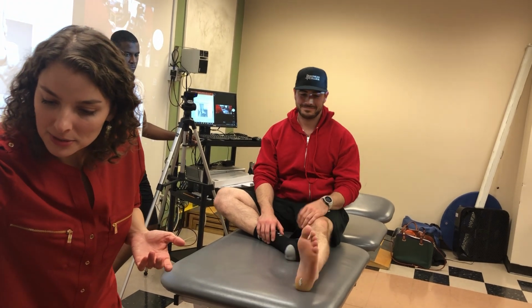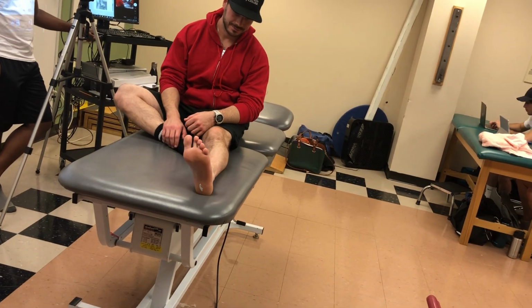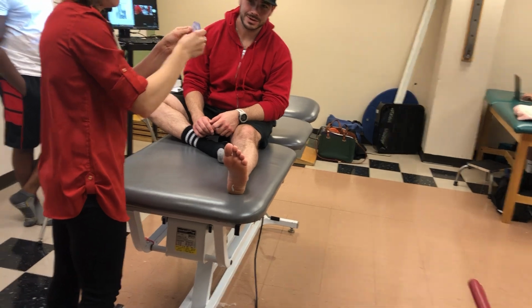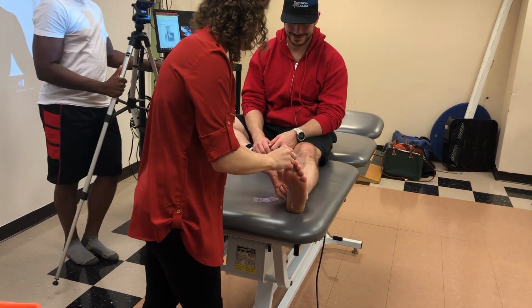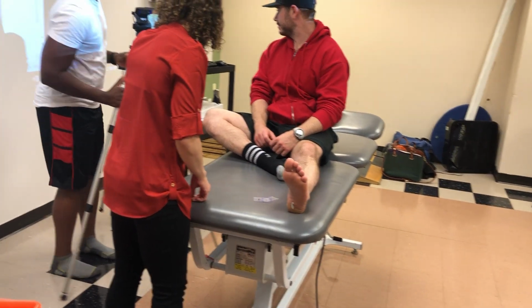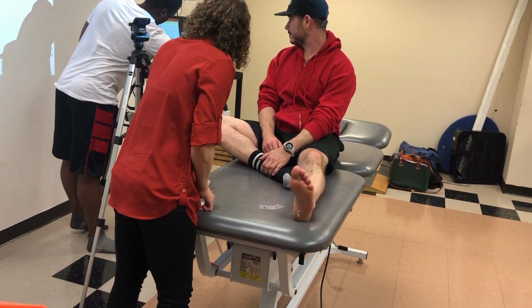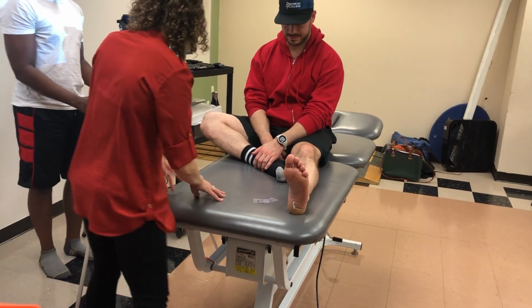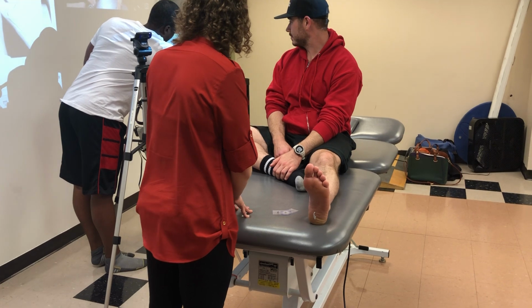So optimally, we would use one of these smaller guys to measure. Oh, thank you. Do you mind hitting going forwards on the PowerPoint to your figure? Forward like this? Yeah. Right there. Okay, good. And then just scroll to the side a little bit. I just want to show the alignment of it.